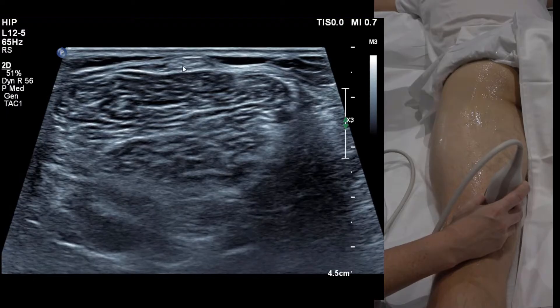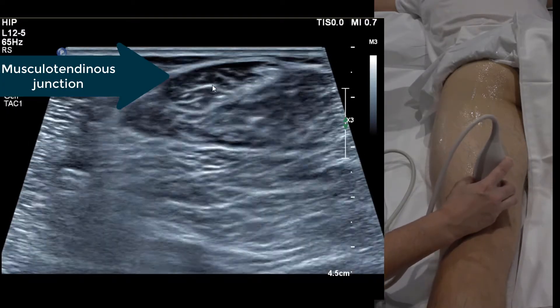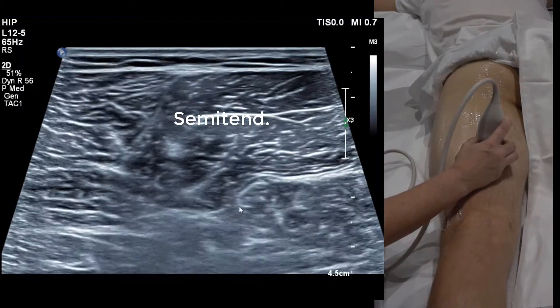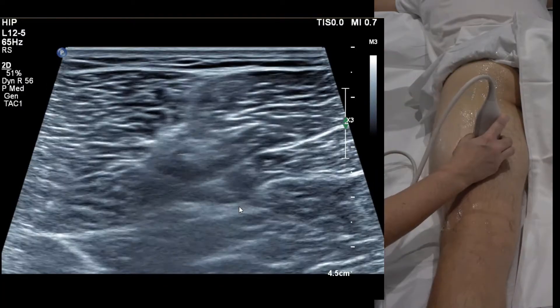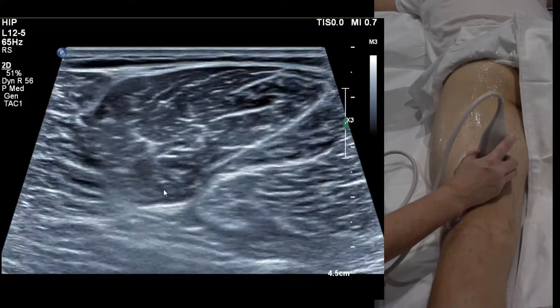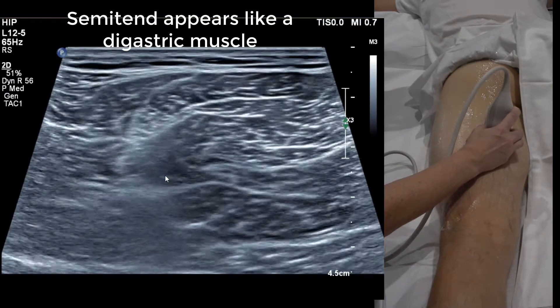The skinny semitendinosus at the bottom is going to become large towards the top — as you move the camera up, you can see it fans out. A very characteristic thing happens about two hand spans below the gluteal fold: it looks like a Venetian blind, with a little fascia running through it vertically, like someone opening a curtain.